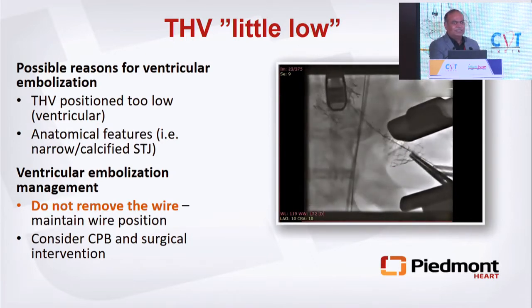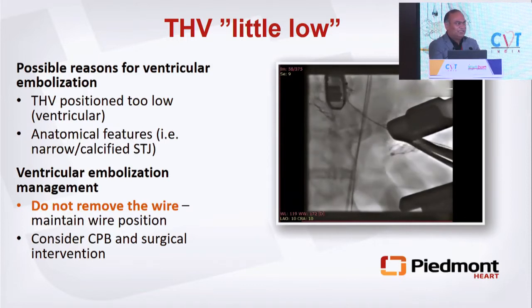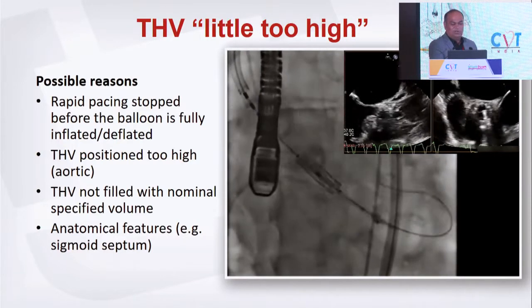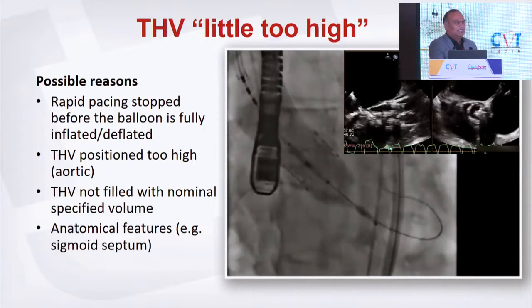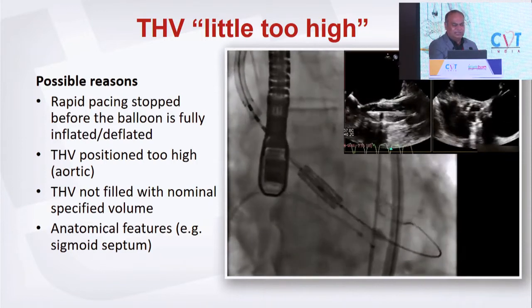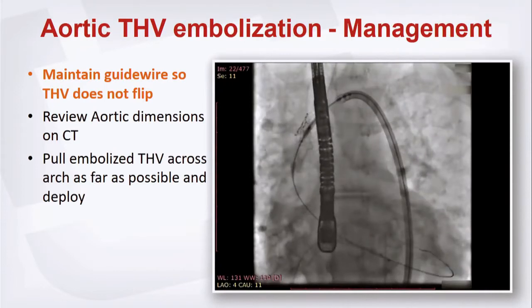And then it's a surgical explant only. You can only imagine what happened to the LV apex here. Sapien, not only too low, it can be too high also. Like, look at this case. Started very well, lost capture, and the balloon was deflated when the capture was lost. Ended up in the aorta. Right? Too high. What to do after that happens?